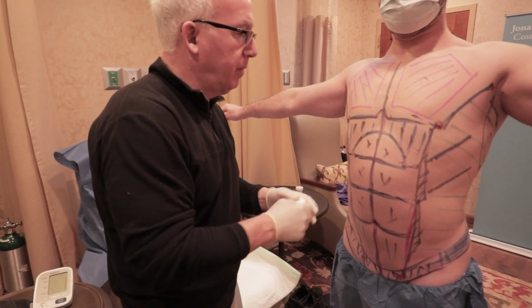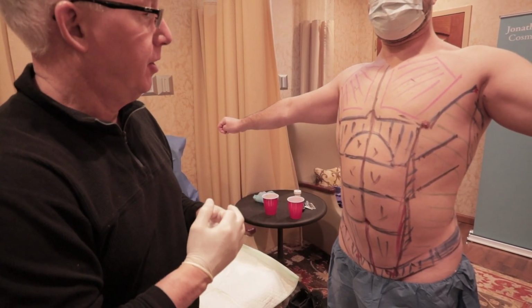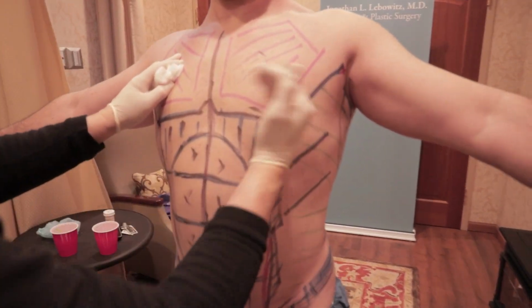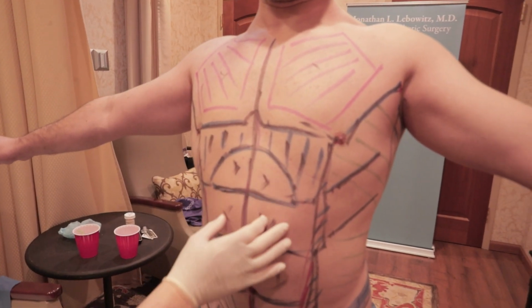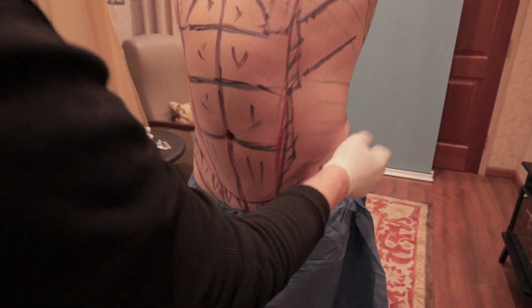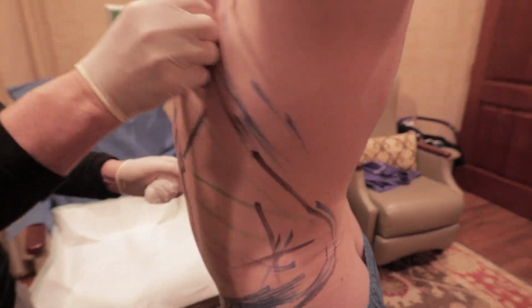All right, so the anatomy markings are just the roadmap to success, the roadmap to perfection. And this is my markings. Pectoral lipofilling. The hockey stick look to his pectoralis major muscle right there. The six-pack going on, the midline linea alba, the semilunaris down to the V to P. The FUPA, getting all that FUPA out. He busted my ass to get this. We're going to do it.